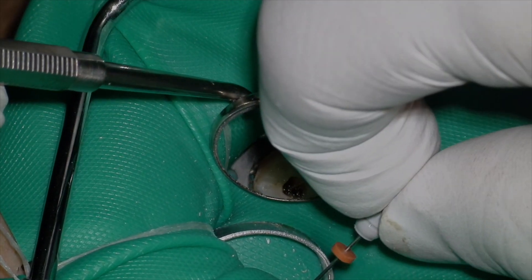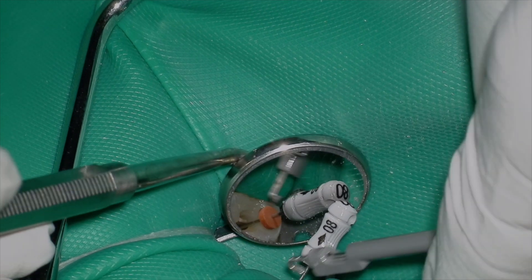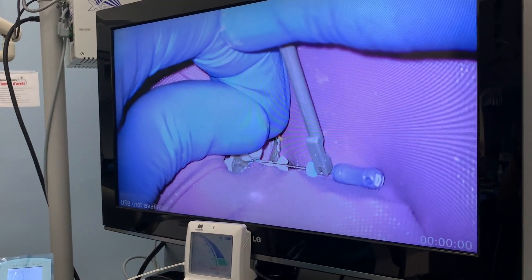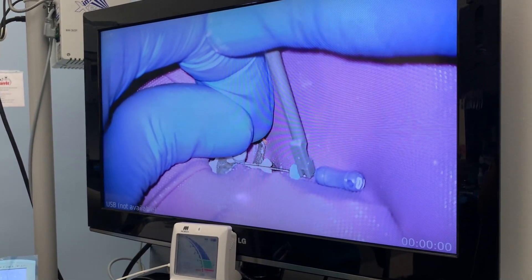Another technique I was told by my buddy is to use a 31mm file. Here on tooth number 27, we're using a 31mm file to get the length — that's another tip you can do. But honestly, trying to get a 31mm file in posterior teeth sometimes is really complicated. So that's why this technique is absolutely phenomenal. Let me know what you think, and thanks so much, Dr. Smiley.